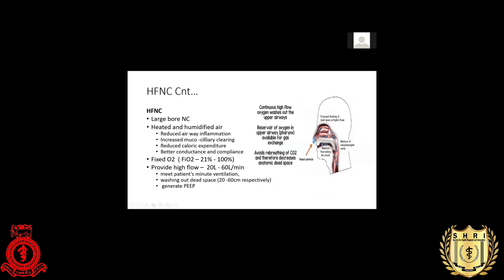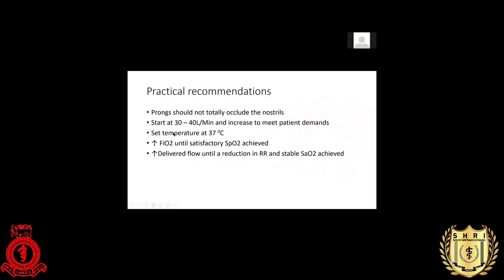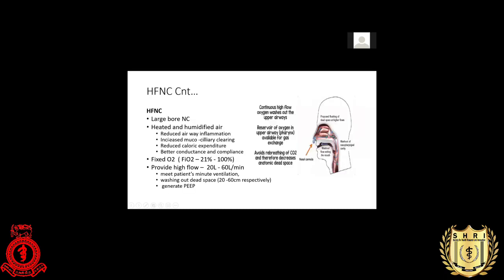Because of that, it will reduce airway inflammation. If you send cold and dry air, that causes irritation to your nasal passage and also reduces normal mucociliary function, and you end up with a collection of mucus. So that can be eliminated by using heated and humidified air.